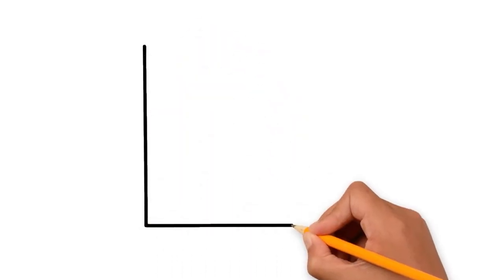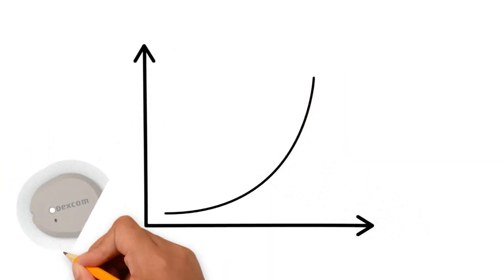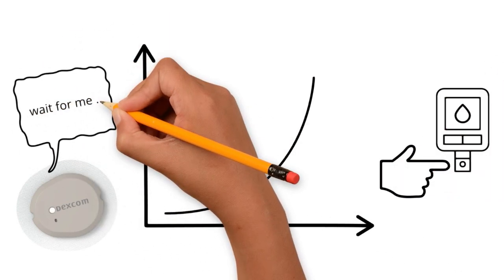One situation where the meter reading and the CGM reading might be very different is when blood sugars are changing rapidly. So let's say that your blood sugars are rising quickly while your Dexcom is playing catch up in the sense that it's 5 to 10 minutes behind, but it also only updates your reading every 5 minutes. But if your blood sugars are stable, you should expect your glucometer reading and your Dexcom reading to be fairly close. Dexcom actually has a rule of thumb as well as a whole chart that you can use to assess whether or not your sensor is accurate.